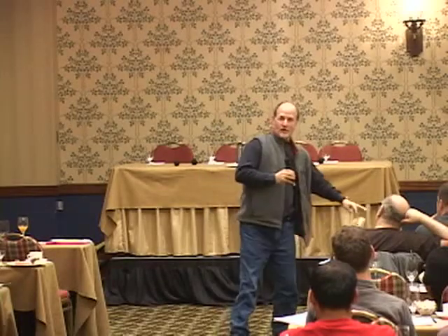So if this is you as the patient, I'll give you one option. Option A is I'm going to admit you, they're going to take you up to the cath lab, they're going to put this needle in your groin right here, it's going to go up to your heart, you're going to lie on the table, they're going to turn you this way and that, and they're going to squirt this stuff in you. And it's sort of interesting what it does. It gives you a lot of ventricular rhythms. That's sort of cool to experience.